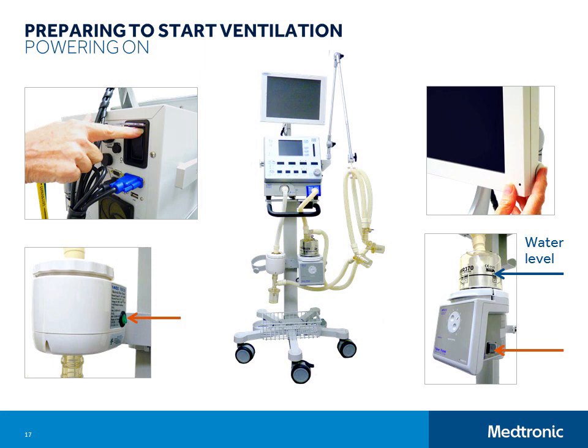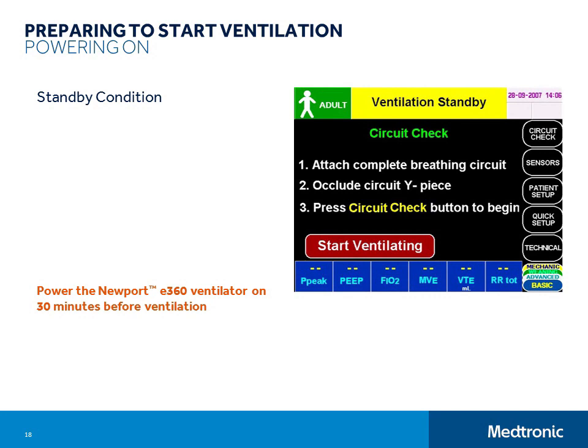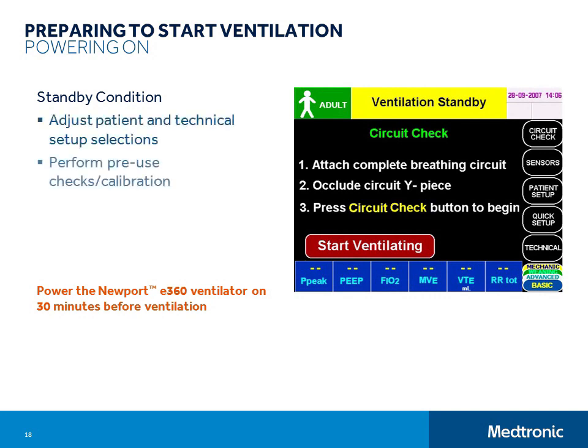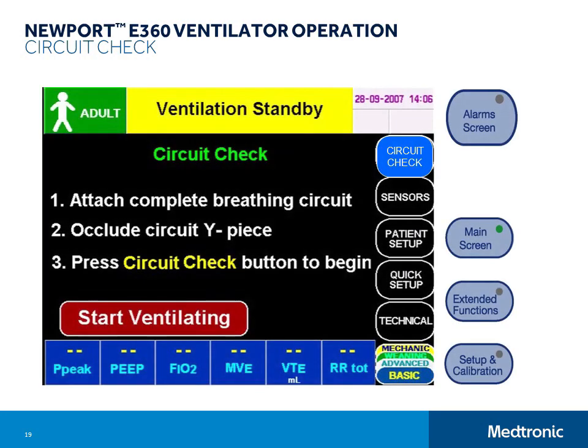you can adjust patient and technical setup selections, perform the pre-use circuit check and calibrations, use quick setup to automatically adjust the ventilation and alarm settings based on ideal body weight, or manually adjust these settings, and of course, you can start ventilating. For the best ventilator performance, you should perform the circuit check and the oxygen sensor calibration each time you set up the ventilator for patient use. They are both quick and easy to do.